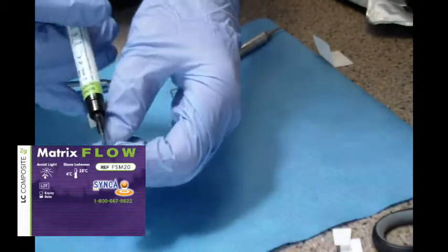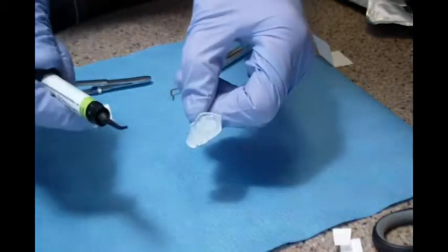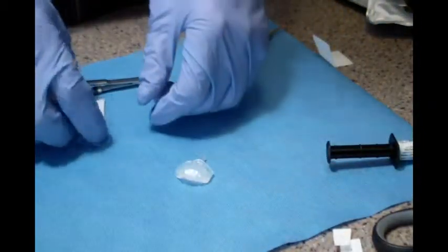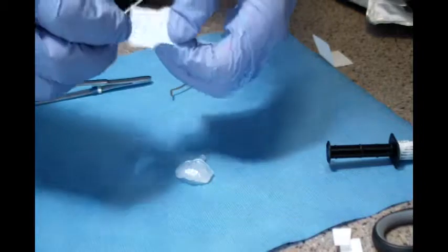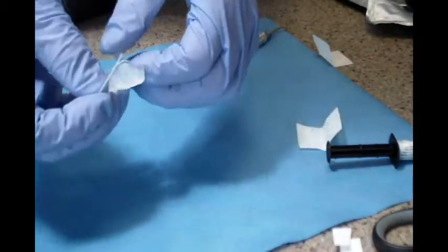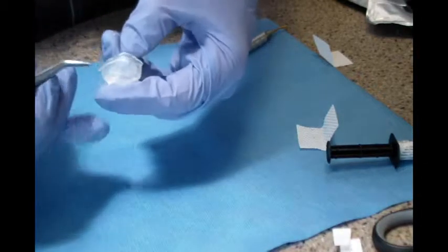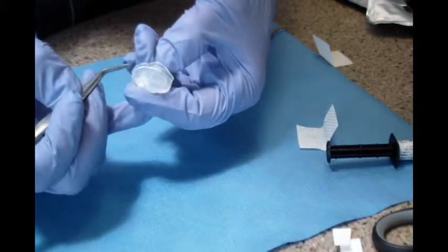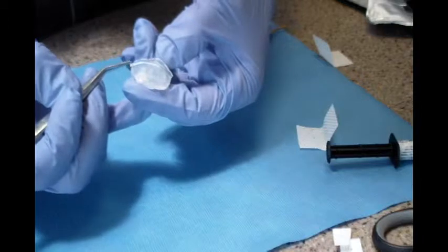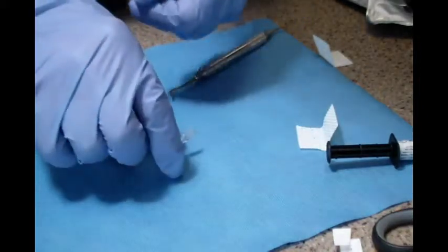Inject a thin layer of matrix flow composite into the negative space or trough on the lingual surface of the silicone index. Remove the pre-measured length of compressible fiber from the protective plastic and place the fiber inside the index trough. Make sure that the fiber is placed completely inside the space and that no loose ends are sticking out from the sides of the trough. The index with the fiber length in place is now ready to be inserted intra-orally. Be sure to protect the index and the fiber from direct light at this phase, as the fiber and composite may cure prematurely. You may choose to complete the last few steps after the two surfaces are prepared.